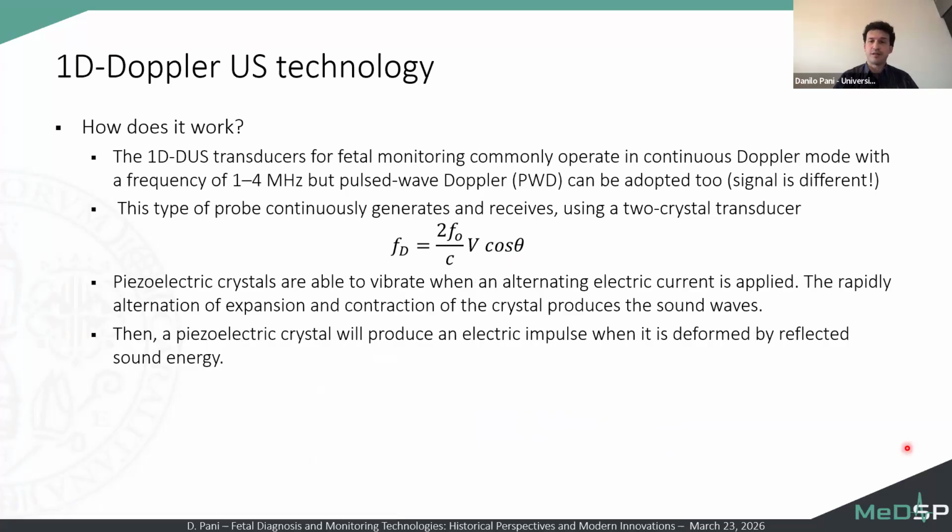For this device, a piezoelectric crystal is used that can be used as an actuator and also as a sensor, because when it is excited by an electric alternating current, it operates generating the ultrasound, whereas it can be used as a sensor when it changes the electrical parameters according to a vibration received in input, in this case from the maternal abdomen, as the echo of the organs that have been invested by the waveform.